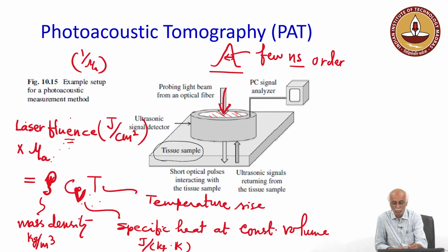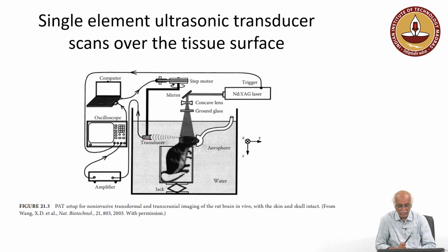It will be very small, because most of the input laser is absorbed by the absorber, which is nothing but the tissue structure, and it will generate acoustic waves. If we have a detector system surrounding this, we will be able to capture the signal, and that can be analyzed to capture the information.